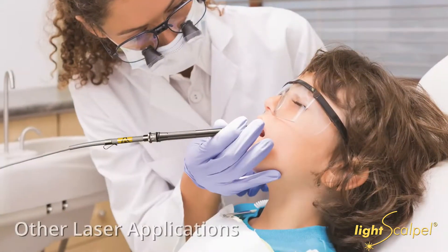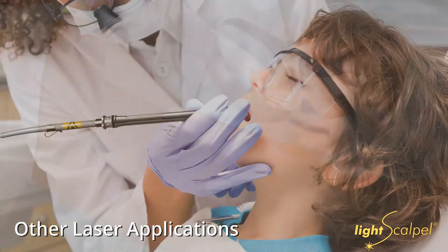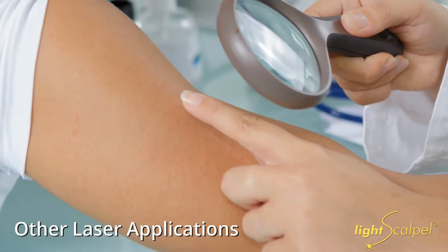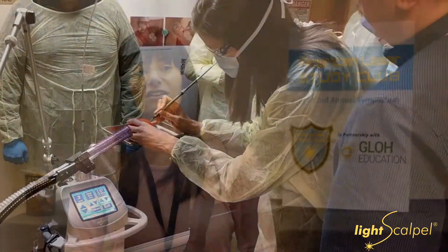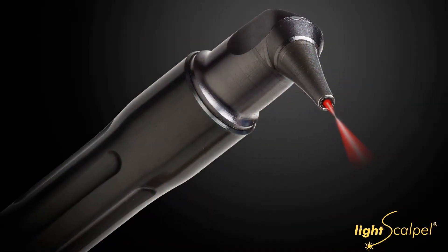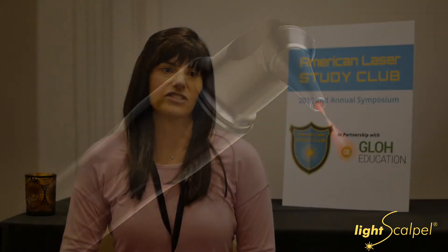I'm primarily using the LightScalpel for frenectomies, but I have also removed some moles, treated adhesions from a bad circumcision, and used it on my dad, who's diabetic — he had a horrible wound on his leg that they were trying to treat with silver nitrate and scraping. I actually used the laser to debride the wound every two days, and they were pretty impressed with how well it healed. With a wound you can take just the top layer of old tissue off and leave the new tissue, which you can't do with a scalpel.